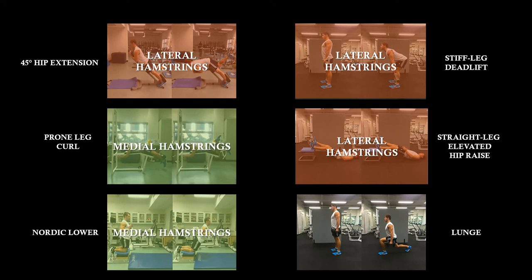So this was a bit of a red herring. This is a very poor movement for the hamstrings, as is the squat, as is any exercise that requires simultaneous hip flexion and knee flexion. So just take away that neither sign that I put up there.